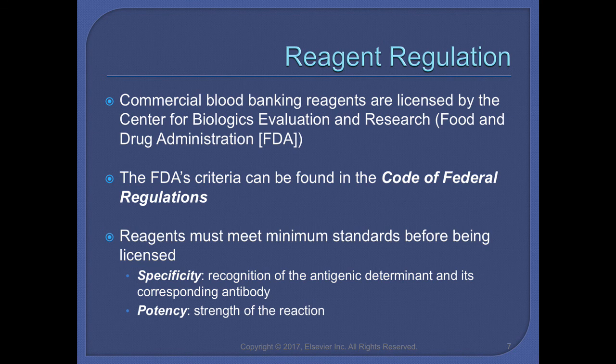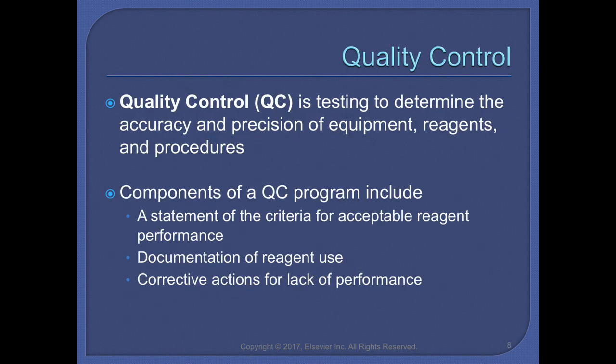They also provide you with the procedure for proper use of that reagent, and the specific performance characteristics, and also limitations of the reagent. So what is it not going to be able to detect, and also in what instances should you not use the reagents.